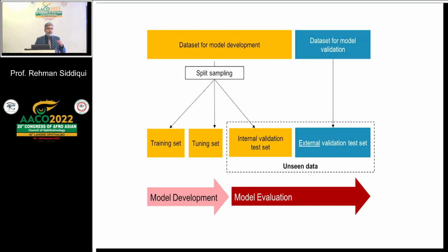One example is that somebody looked at pneumonia prediction from chest X-ray, and the doctors' accuracy was about 80%. The model accuracy was about 97%, and they were surprised how the model was able to identify it. Then they went back and tried to hide areas on the chest X-ray to find out which area it was focusing on more, and it turned out that the model was not looking at the chest X-ray at all.